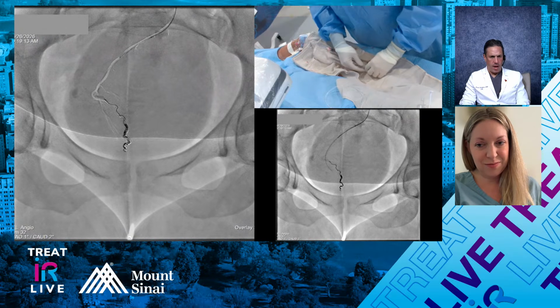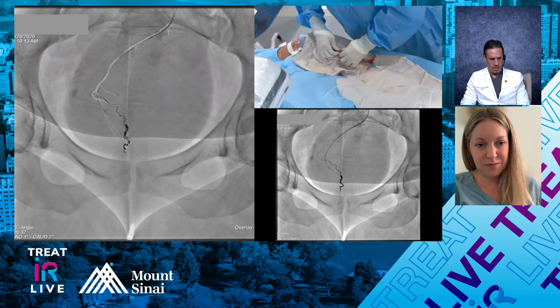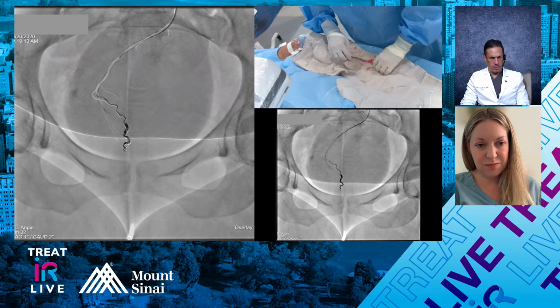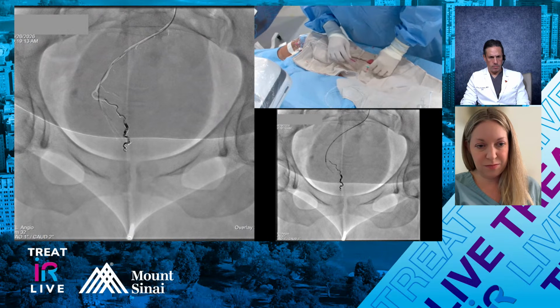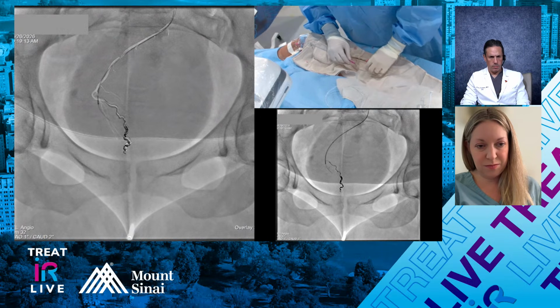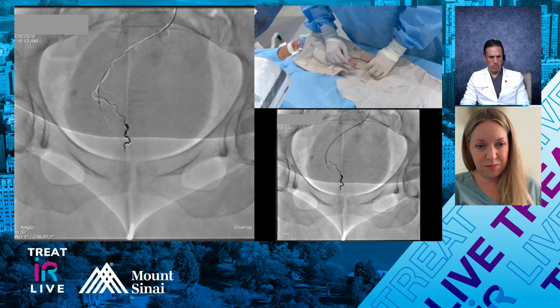Do you think this microcatheter will be able to navigate that tiny vessel, or do you think you need nitro or a smaller catheter? This is a tiny vessel. Looks like it's about a millimeter. It may be occlusive here for sure. I think it'll go. I mean, it's going to deform it with the wire and the microcatheter, so I think it's worth doing a little puff, seeing where we are. I think we have nitro ready too.